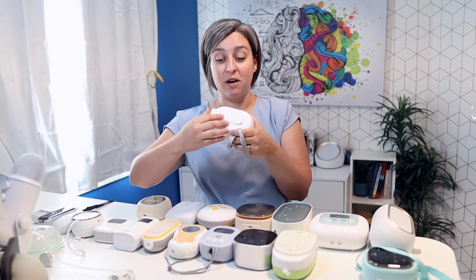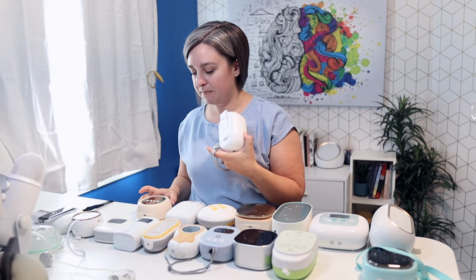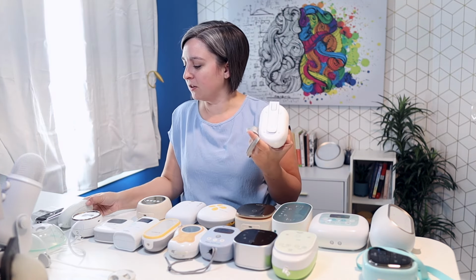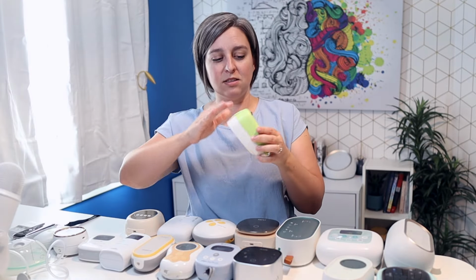This one has a clip as well. So if some of them don't have a lanyard but do have a clip, actually not that many of them, the LV Stride has a clip, I thought. Ardo Alyssa does come with a lanyard and a little sticky thing that you stick to the back. I'm not sure I would trust this nice expensive pump on a sticky lanyard there. But those are just some important features to look at.